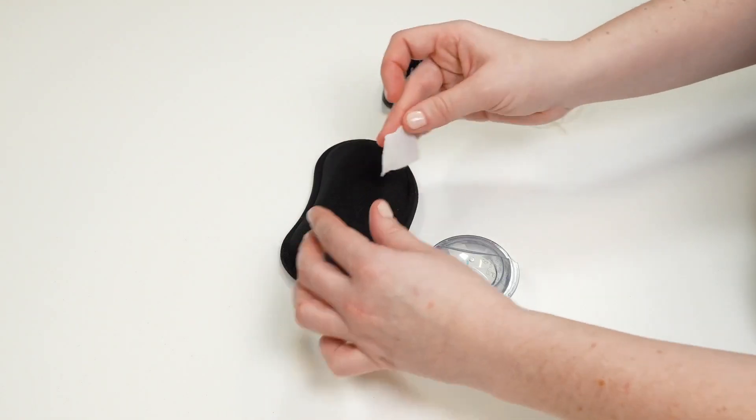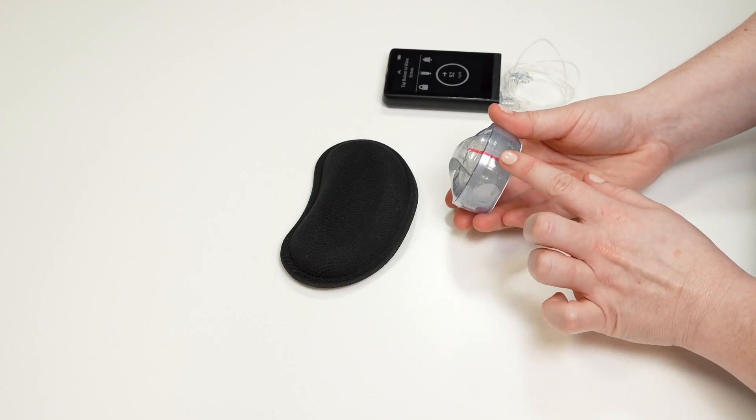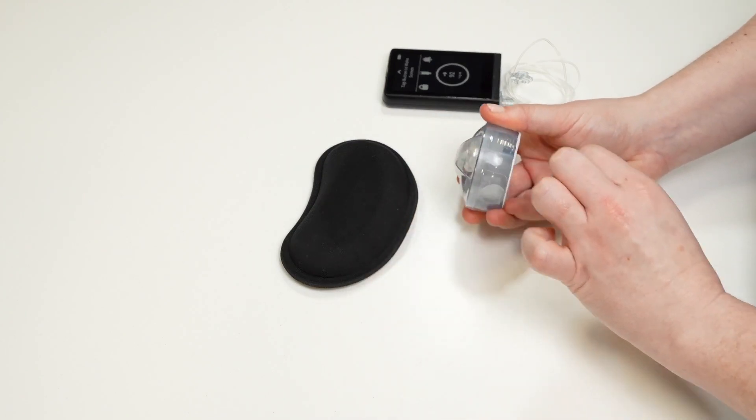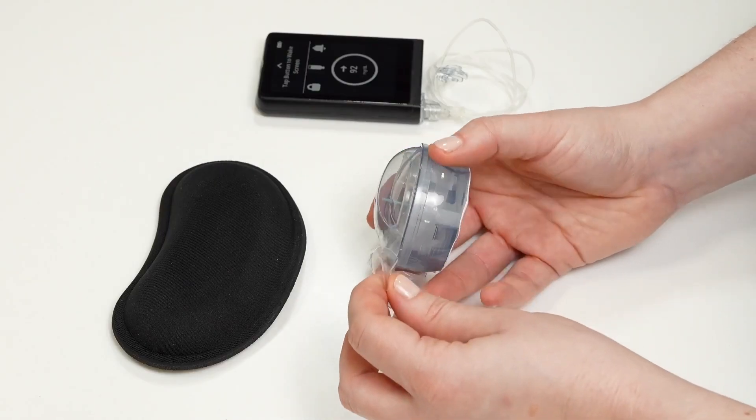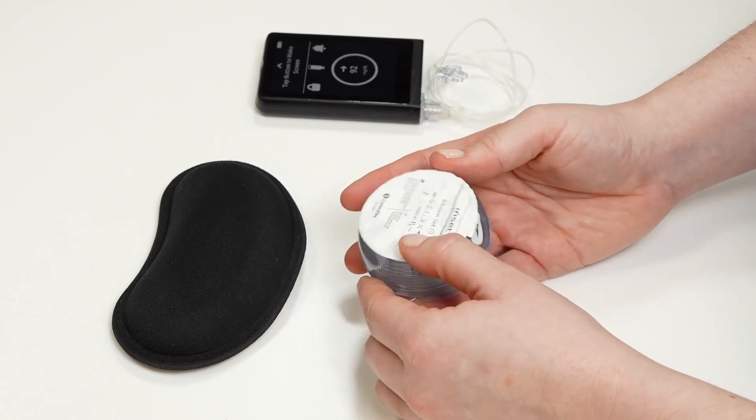Open your inset infusion set by pulling on the red tab and removing the plastic wrapping. Next, use this pull tab to remove the white paper from the bottom.